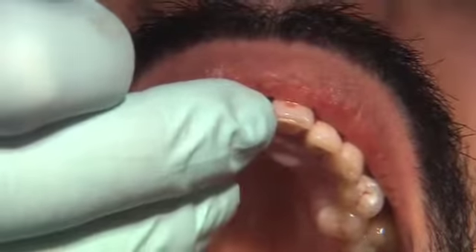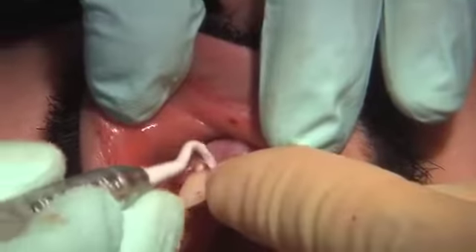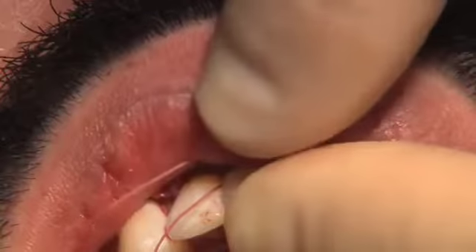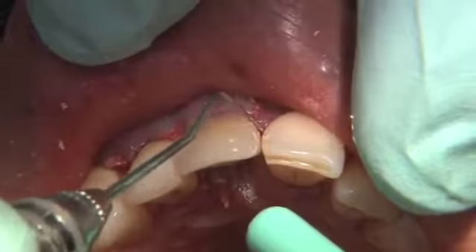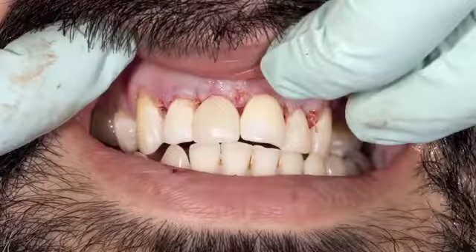The reason for leaving the flap unsutured at this point is to ensure that we can remove fully any temporary cement that exists around the biotemp, which is imperative for the proper healing of the implant and the soft tissue around the area. Once this has been done, the soft tissues around the osteotomy site and the implant site are reapproximated and confirmed again to ensure that there's no residual debris from the temporary cement. And the final result is seen here.